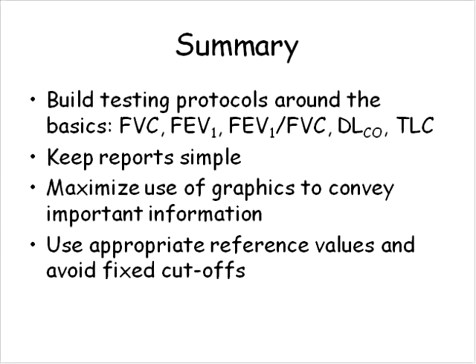Most of the software allows you to mix and match so that you can take the patient's best inspiratory effort and combine that with the best expiratory effort. Again, the expiratory effort should be the one with the largest sum of FEV1 plus FVC. The best inspiratory effort, in my opinion, would be the one that has the largest inspiratory flow. So that's not an easy question, but I think the flow volume loop display is a much better way of conveying whether or not there's upper airway abnormality.